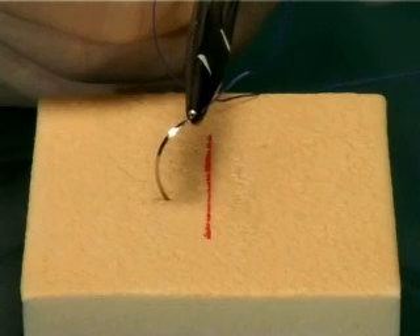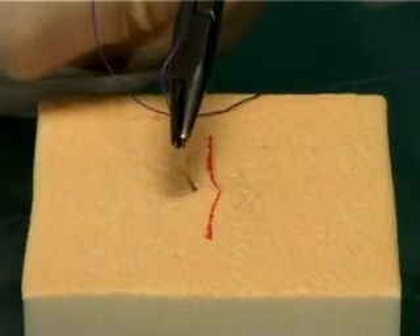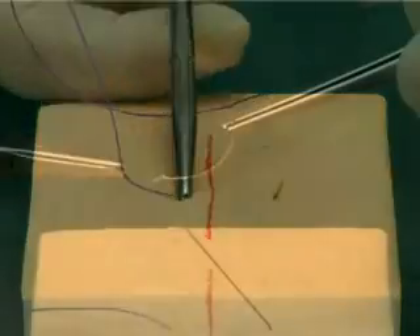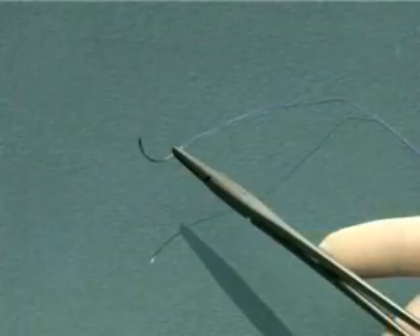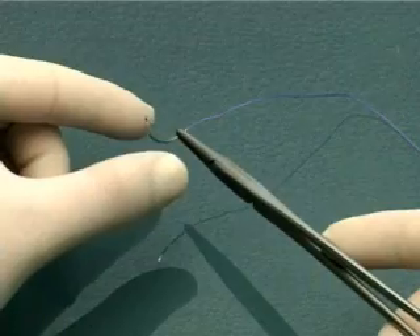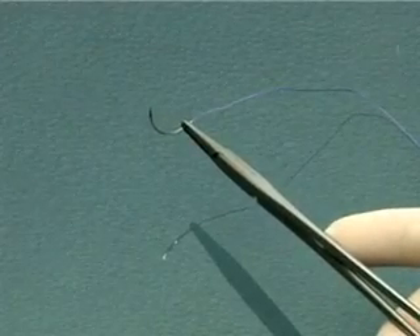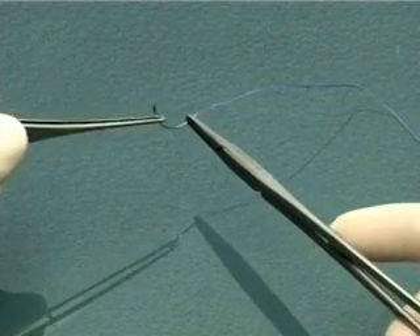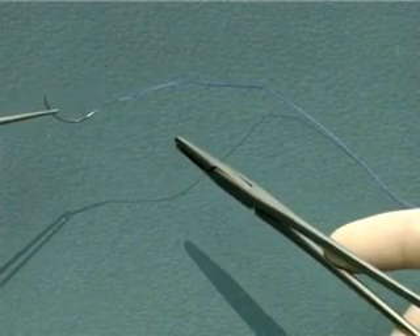Do not load the needle too near the suture end. At this position, the needle will bend when you drive it through the tissues. Avoid holding the needle with your fingers, as this is to avoid accidental needle stick injuries to yourself. Use your forceps instead. Picking up the needle with your fingers can be a difficult habit to break.